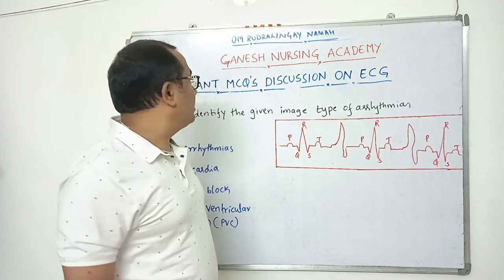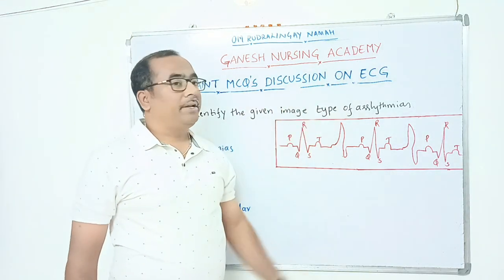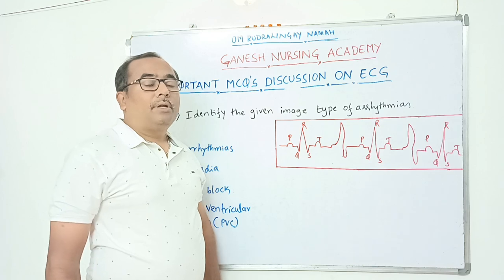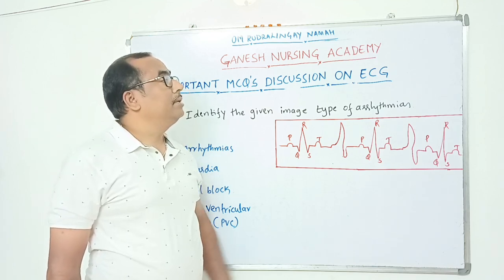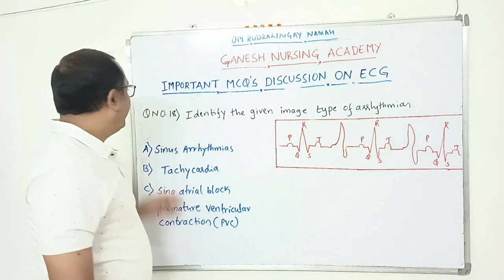Last class we discussed important MCQs on ECG. We had discussed 17 questions. Now let's continue the discussion of important questions on ECG, starting with question number 18.